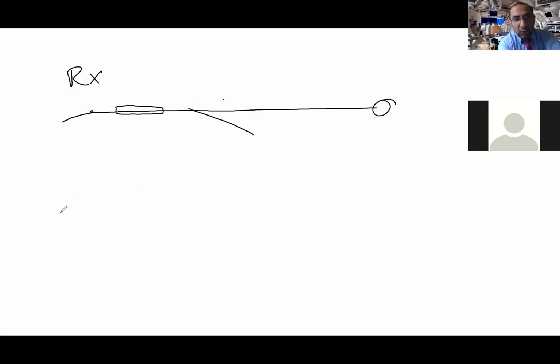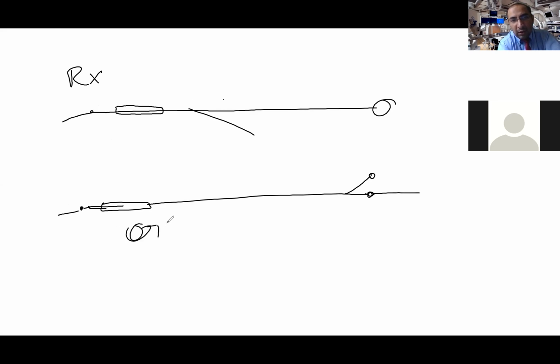The older technology was that you had a hole here, the balloon here, and then there was a hole here at the end. And then you have an inflation port where you can balloon it up, and the wire would come out of here. Okay. So this is called over the wire technology. You will see these terminologies used, and they are now used for different devices as well. Like TAVR is the over the wire technology, because your wire is going from here, coming out the other end, while the rapid exchange is going from here and here. Many types of new technology will be using RX technology.